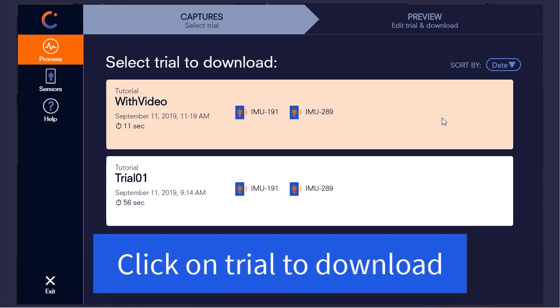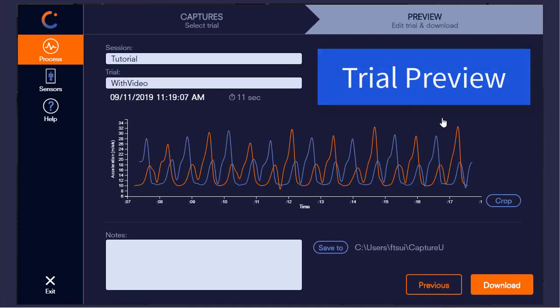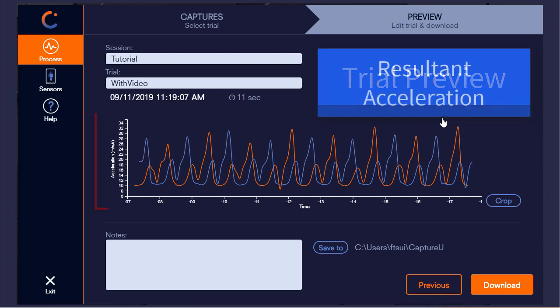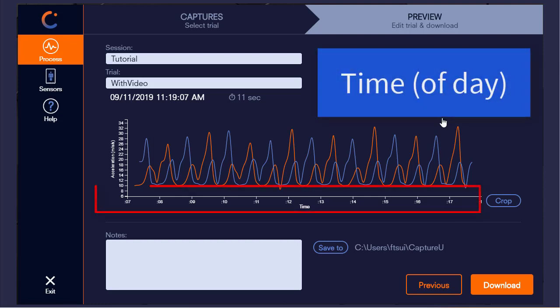To download data from a trial, click on it. This opens a preview of the trial, with the y-axis displaying the resultant accelerations from each sensor, and the x-axis displaying time.